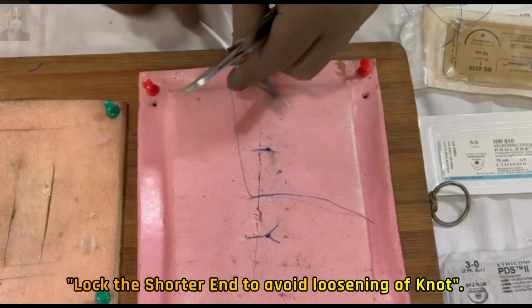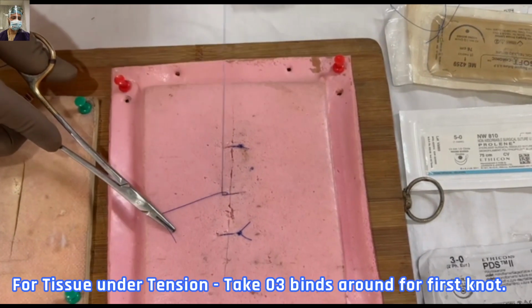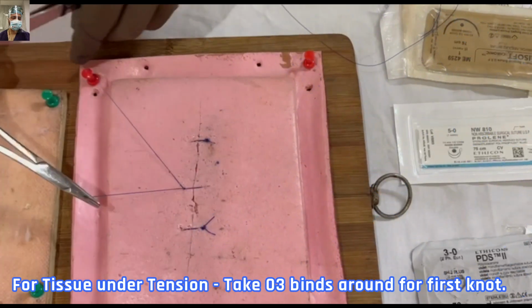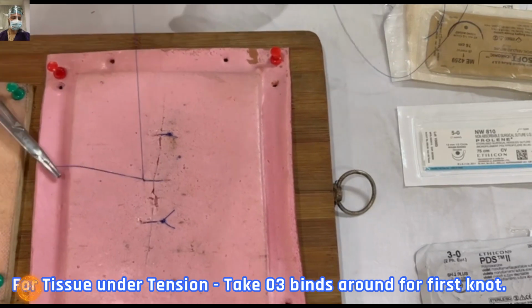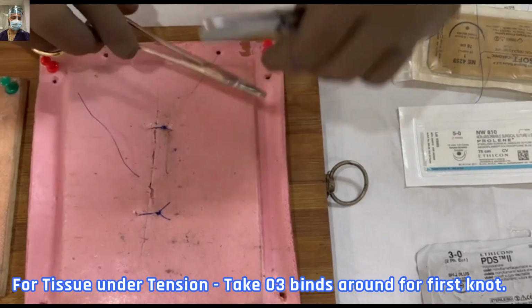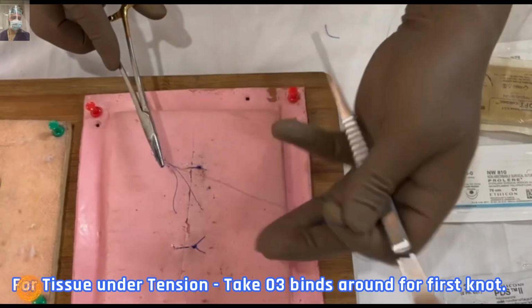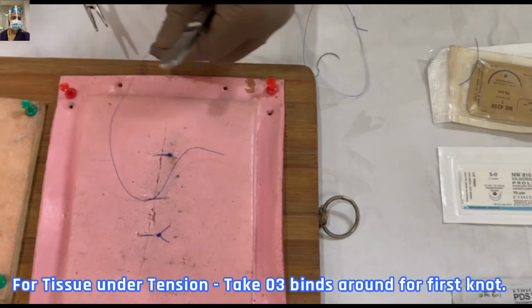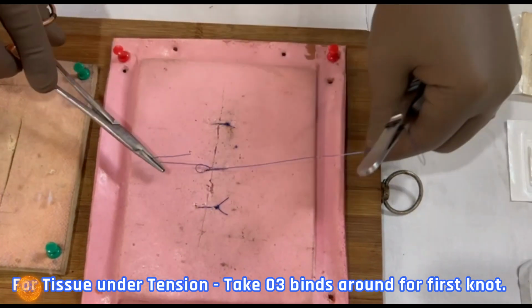So you have to practice this technique of how to lock, because every time you should not ask your assistant to hold the knot for you. That won't look aesthetic. So practice this technique of locking. And again, if you are still facing difficulty holding the tissue edges after the first bite, another technique for you guys is to take 3 throws. Initially we take 2 throws, but you can take 3 throws, and that will hold beautifully. We are using Prolene here, but silk will also hold beautifully.